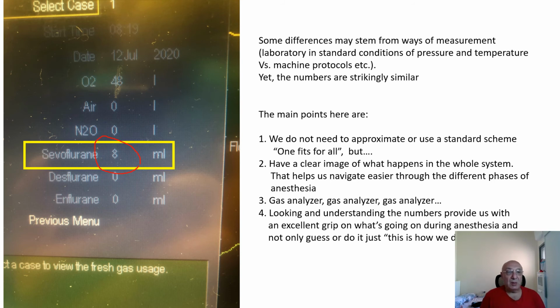So you can read all this text alone. I just want to underline how important it is to have a good grip of what happens in the circuit and make scientific and mathematically based anesthesia with volatiles. I had many opportunities to hear people asked about these flows or the other, being told, well, this is how I'm doing over here, this is how I was told, but nothing related to real calculations.